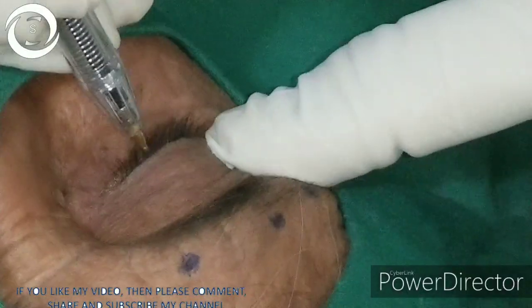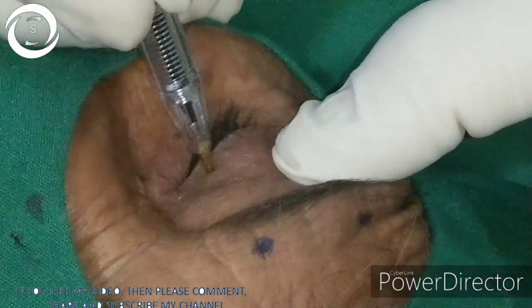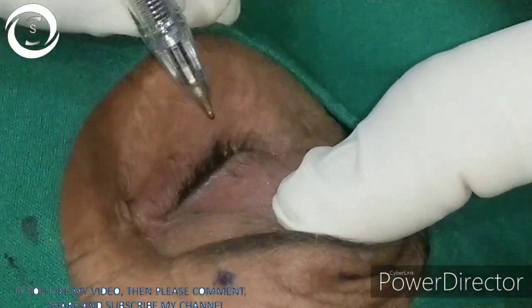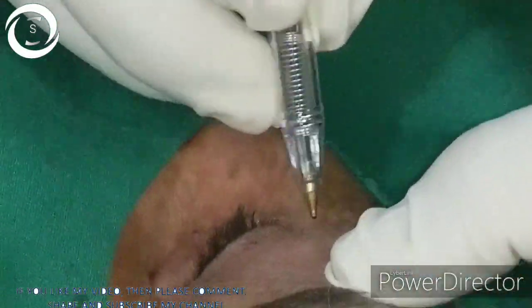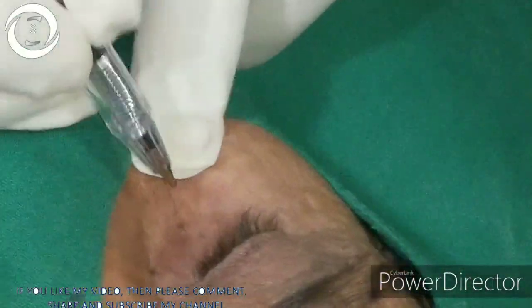Mark the pretarsal lower eyelid orbicularis at two points, compared to three points in the upper eyelid: one in line with the center of the pupil and the other near the lateral canthus. Avoid the medial point near the inferior punctum, otherwise you may cause epiphora — functional nasolacrimal duct blockage.